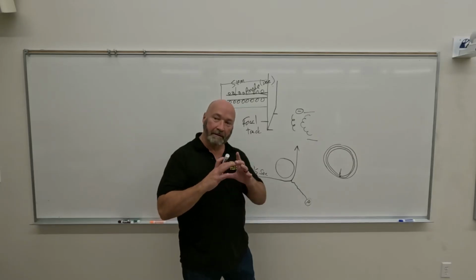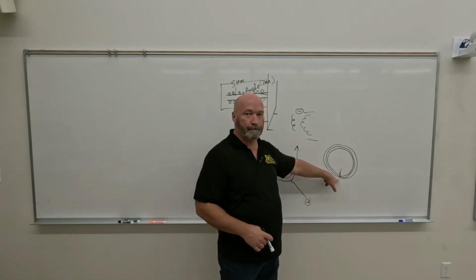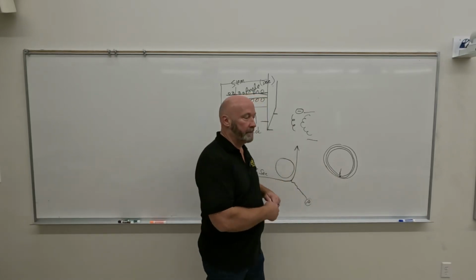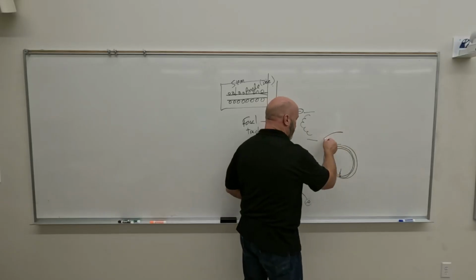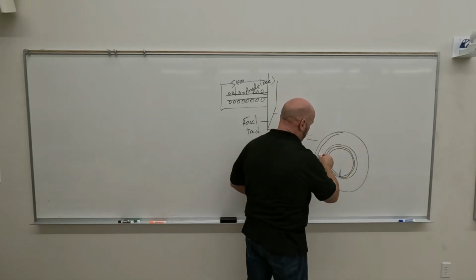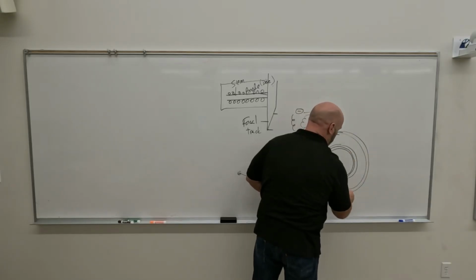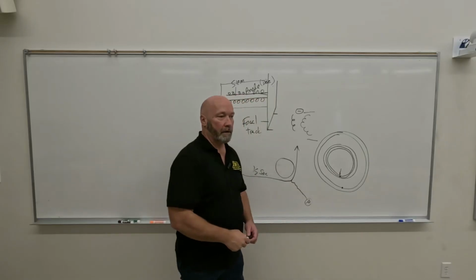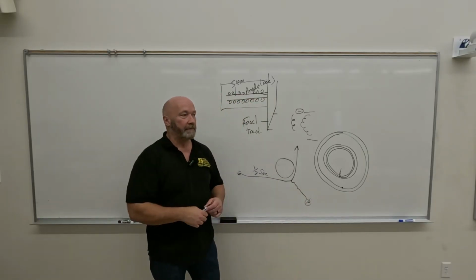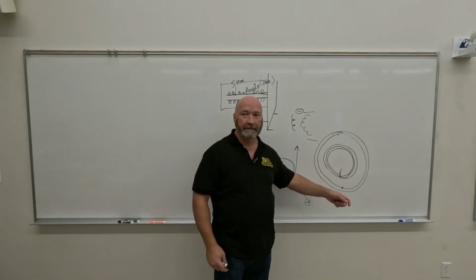We used a relatively large disc for a very small focal spot. Is there something else we could do? Following the same rule, what if our disc was this big and our focal track was that big? You increase the area, right? So you have more room to spread it out. So that's one thing: increase the heat load by increasing the size of the disc.